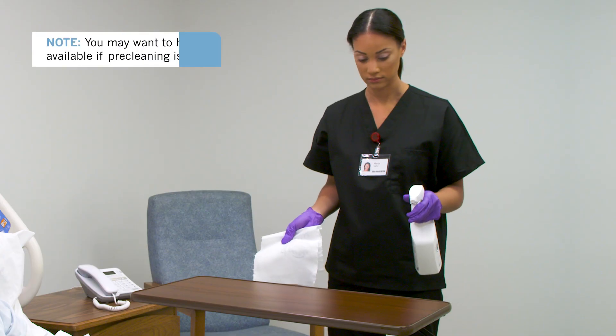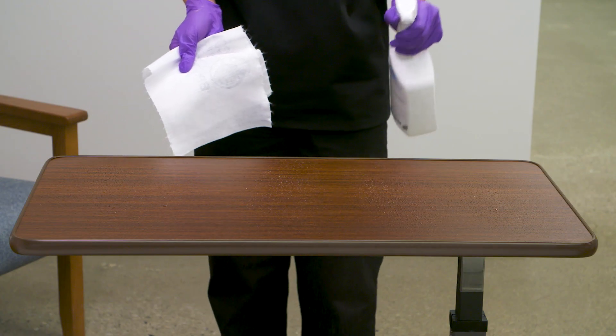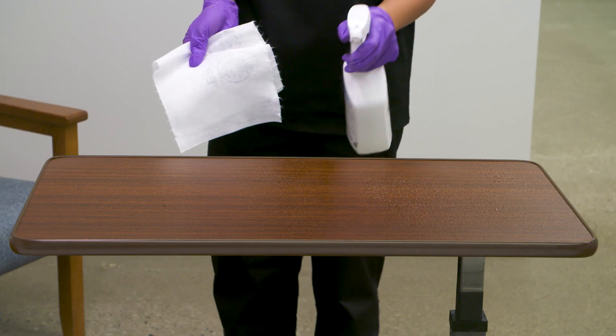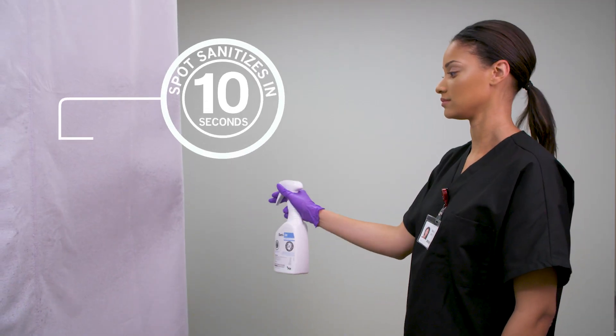For sanitizing on hard, non-porous surfaces, hold container 6 to 8 inches from the surface and spray until thoroughly wet. To spot sanitize soft surfaces, let stand for 10 seconds and allow to air dry.